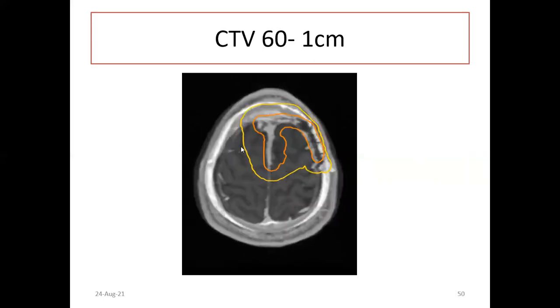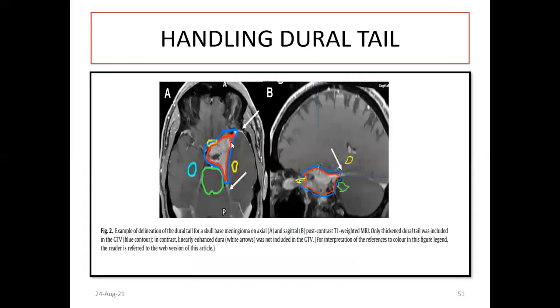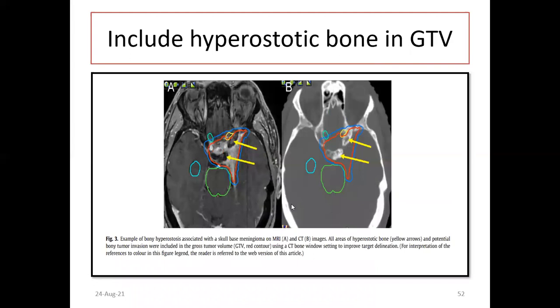Regarding handling of the dural tail in skull-based meningioma delineation: only the thickened dural tail is included, shown in blue. In contrast, linearly enhancing dural structures — shown with white arrows — should not be included in the GTV. Only the thickened and nodular part of the dura is included.